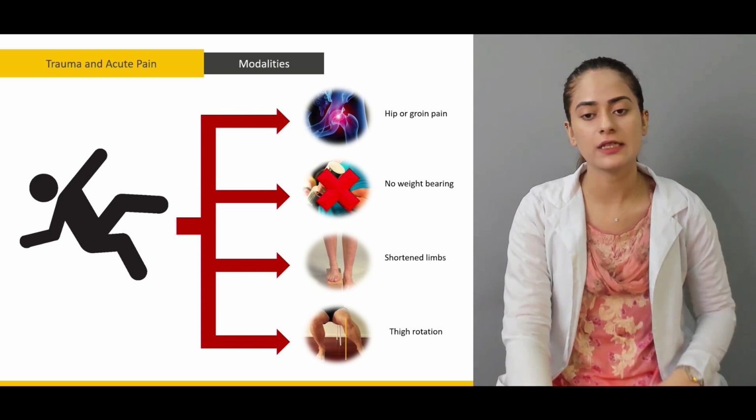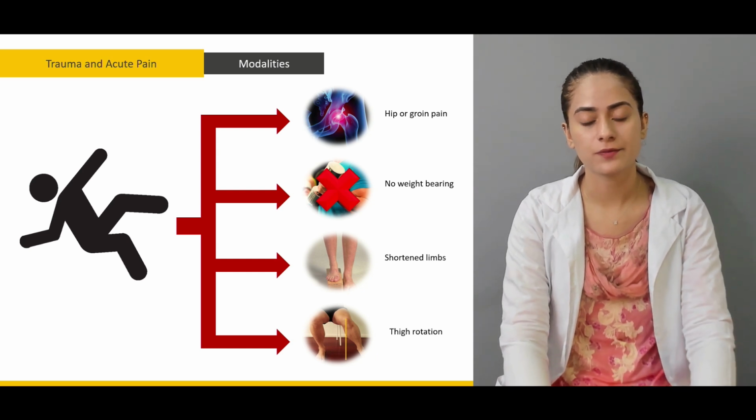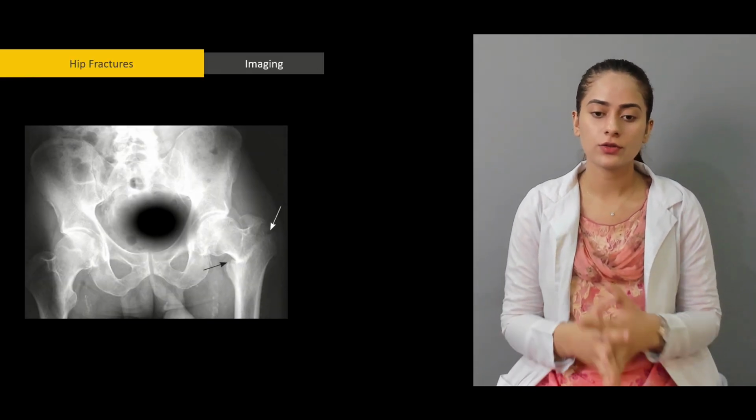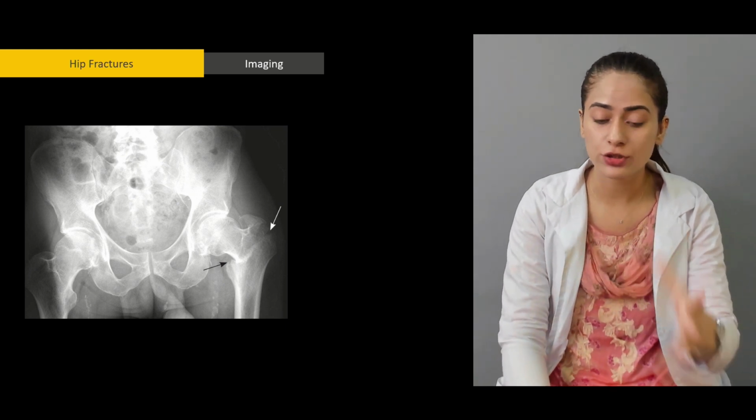If someone experiences these, then they probably suspect some injury has occurred to their hip region. So now we're going to discuss the fractures.